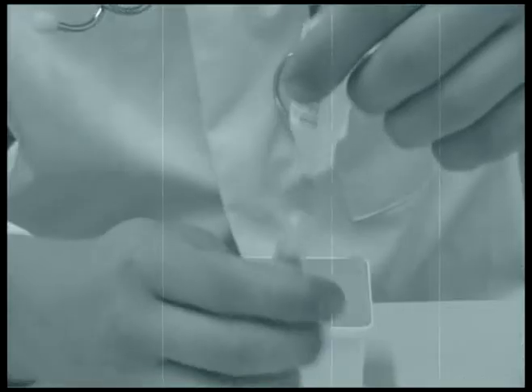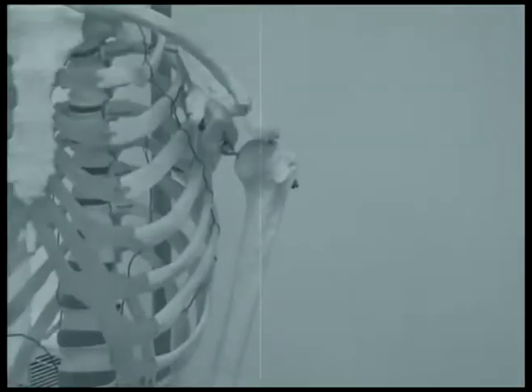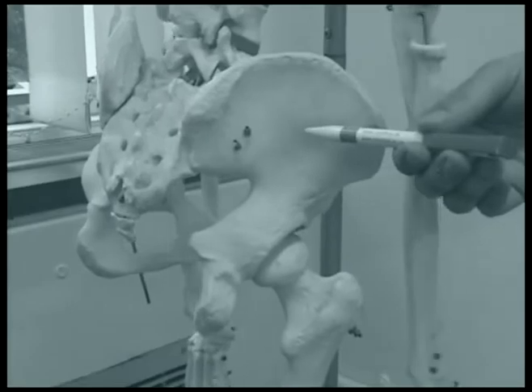Once the drug is prepared to the appropriate dosage, assist the patient into the appropriate position. Suitable sites include the upper arm and upper lateral gluteus maximus muscle.